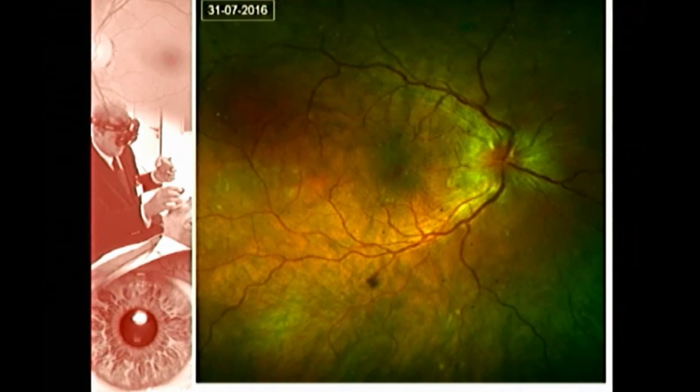But how many of these patients presented with choroidal folds and choroidal thickening? As you see, it has diffused. Well, actually, there is not. Multifocal choroiditis, we talk about it with serpiginous or subretinal fibrosis, is another entity we have. Actually, it is different. Usually they have multiple focal choroiditis that is deep. You can easily discover it with fluorescein angiography and ICG, which is not the case here.